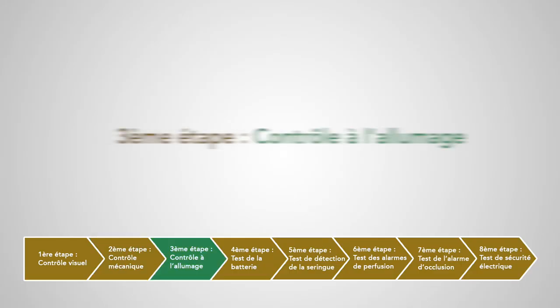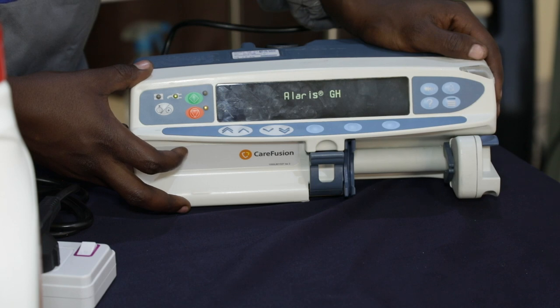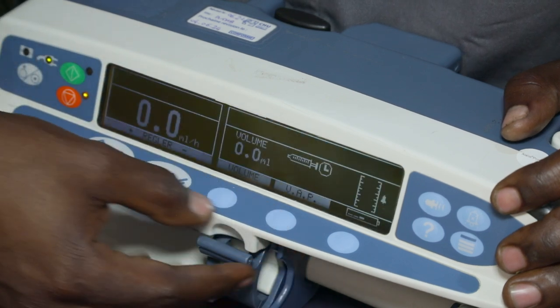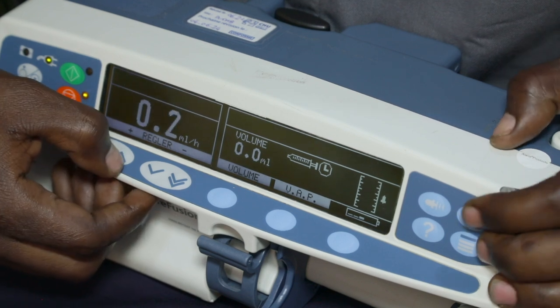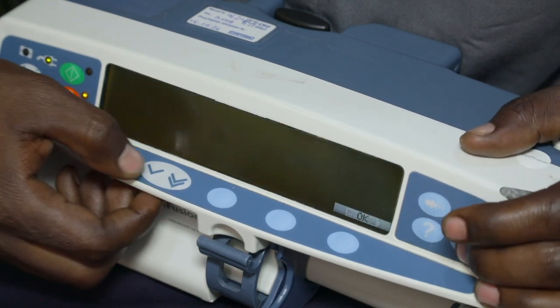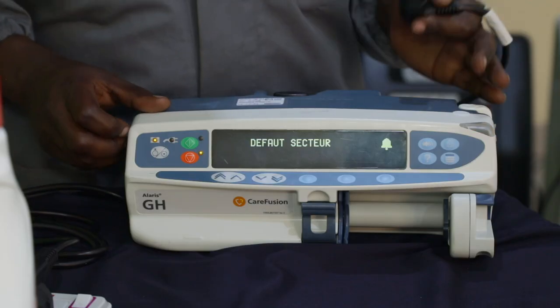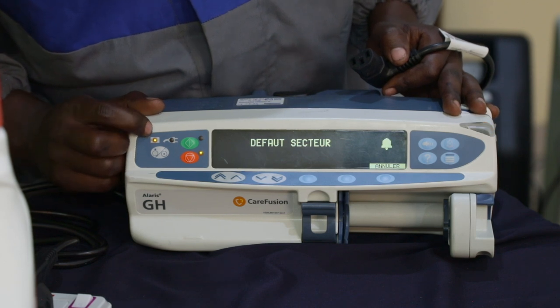Troisième étape : contrôle à l'allumage. On va brancher et allumer notre appareil, et vérifier que les voyants s'allument et qu'un bip sonore retentisse. On va vérifier le bon fonctionnement de tous les boutons. Ensuite, on va débrancher notre appareil et vérifier le déclenchement d'une alarme, ainsi que le voyant de la batterie s'allume à la place du voyant secteur.